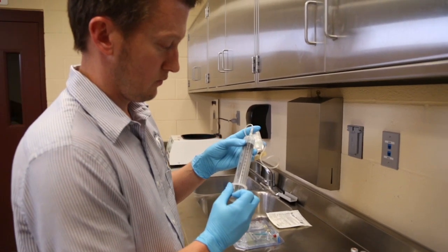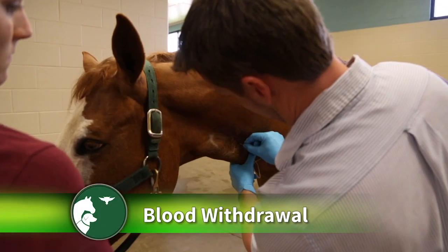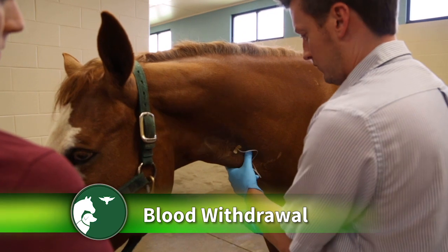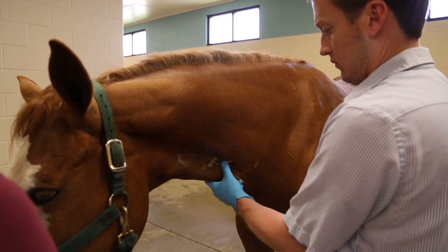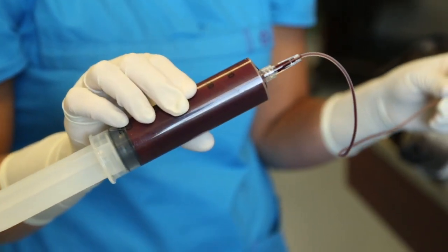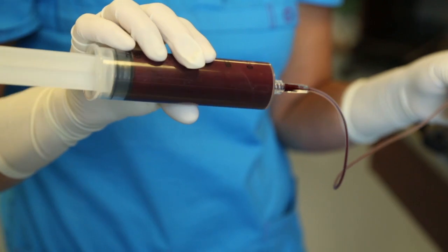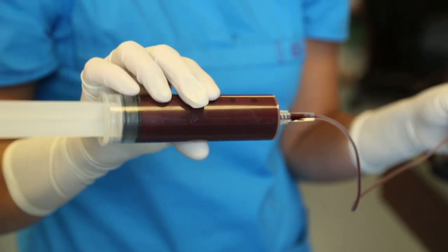Express ACDA until a few drops exit the needle. Draw the blood slowly at a rate of 1 ml per second until 60 ml, including previously added ACDA, is collected in the syringe. Clotting of blood can be prevented by frequently inverting the syringe during blood draw to ensure adequate mixing of whole blood and ACDA.